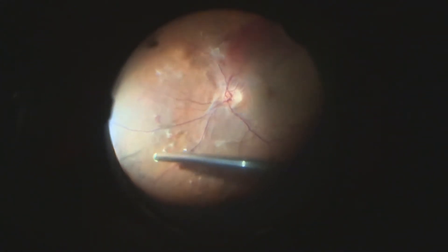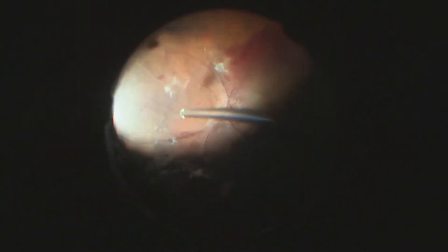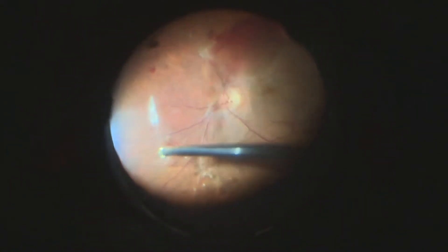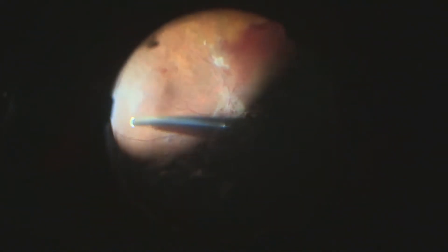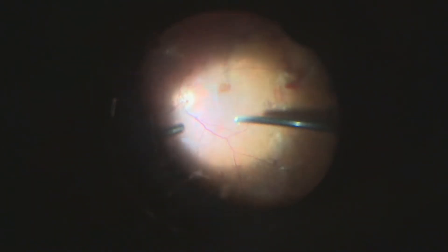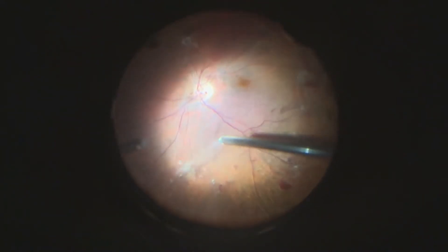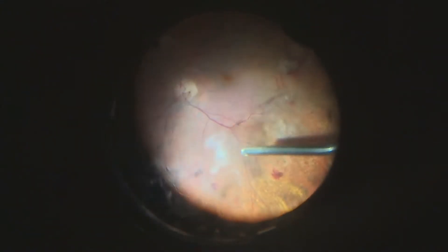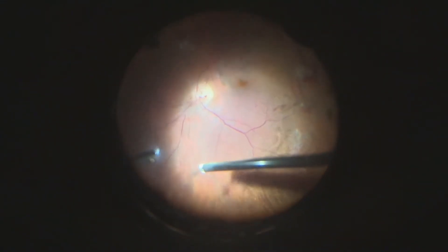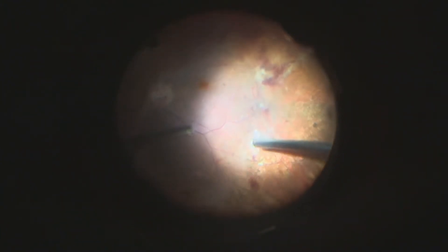In our mind, it's prohibited. We never perform aggressive laser at the equator or inside the macular region. In our mind, avoiding destruction of extensive colonies of photoreceptors is very important for the patient's visual field in the near future.